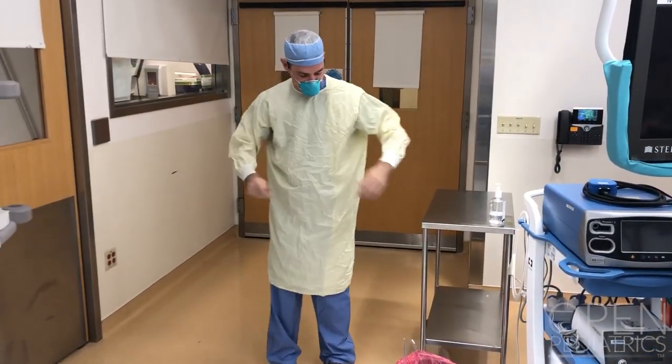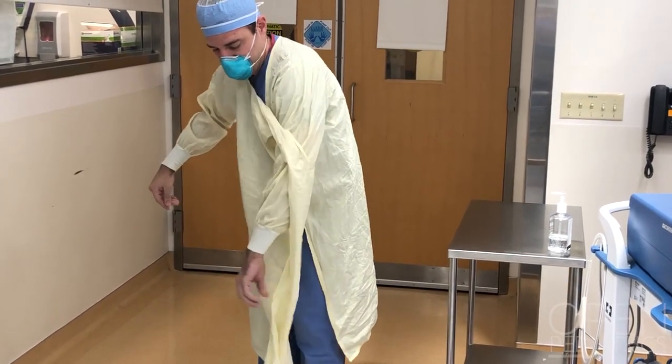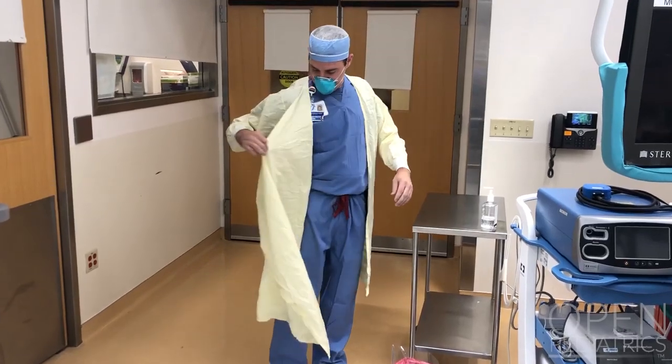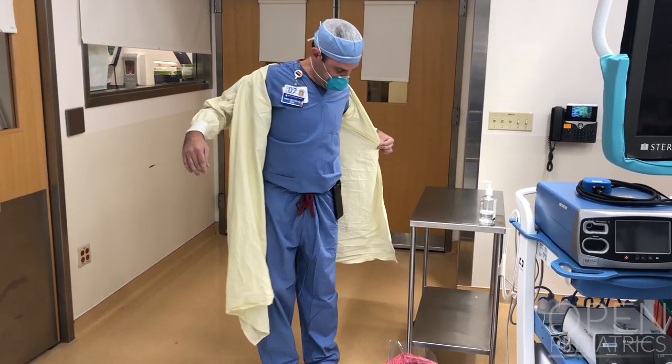Removing the gown can be quite tricky, but the most important thing is to follow the simple principle that the outside of the gown — particularly the front part — is dirty, while the inside of the gown is considered clean. You want to avoid reaching across your body and avoid reaching in front of your face. There's no perfect way to do this, but pay special attention to avoiding contamination.